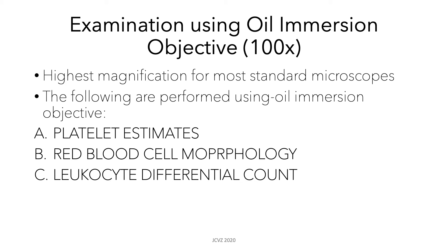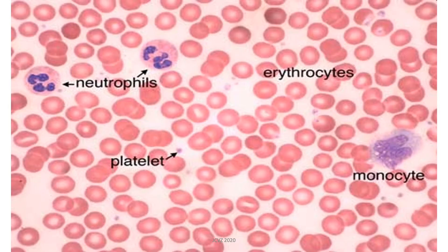Using the oil immersion objective, or 100x magnification — the highest magnification in most standard microscopes — the following procedures are performed: platelet estimates, examination of red blood cell morphology, and leukocyte or differential counts. Here you can see the different types of blood cells under the oil objective: neutrophils, which are the segmented cells on the upper left; a monocyte with a kidney-shaped nucleus; platelets, which are small purple cell-like structures; and erythrocytes with their signature salmon pink color and central pallor.